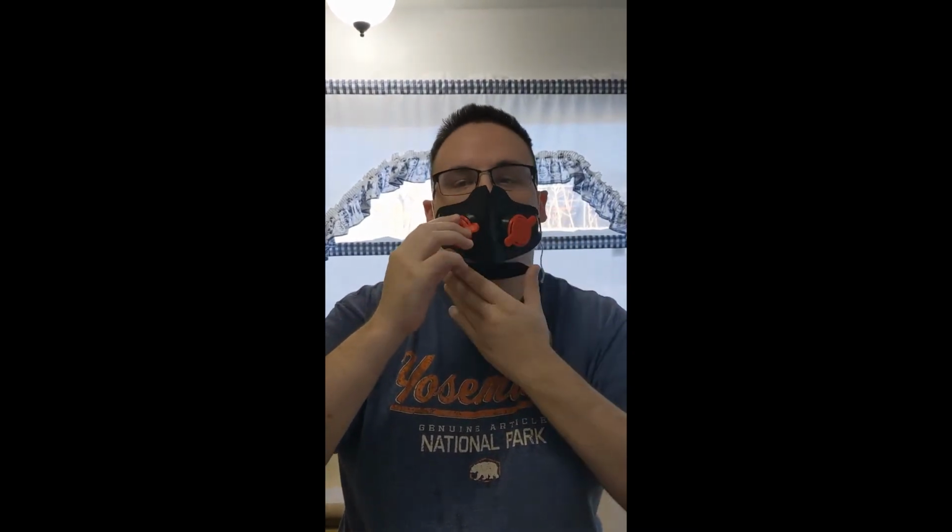So, even just trying to fit it on, it's going to take a lot to thermoform this. So maybe if I use a heat gun or a hairdryer, I can maybe get this to work. But I'm having a lot of problem getting this part here to fit around my nose. And I could already tell I'm not getting a seal at all around the chin here, so I'd have to come in and hot glue or seal this up.